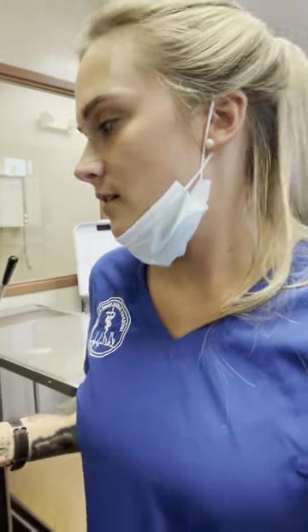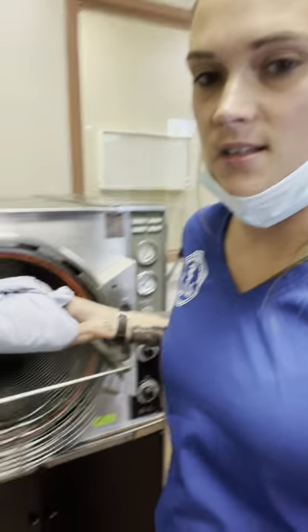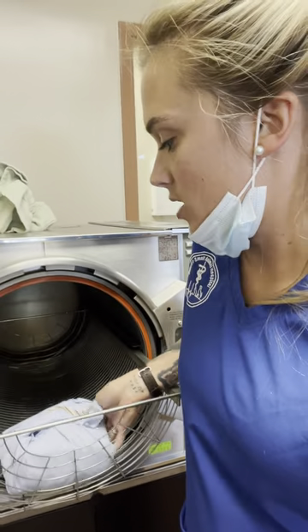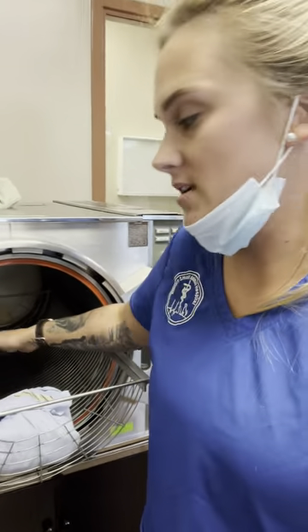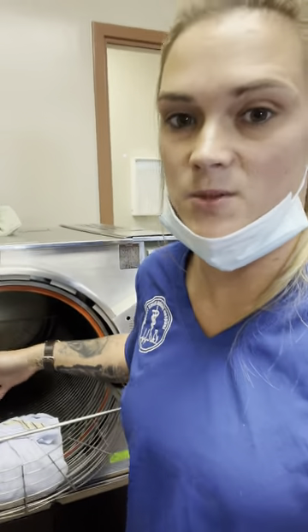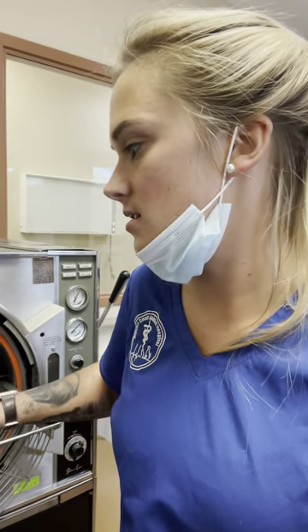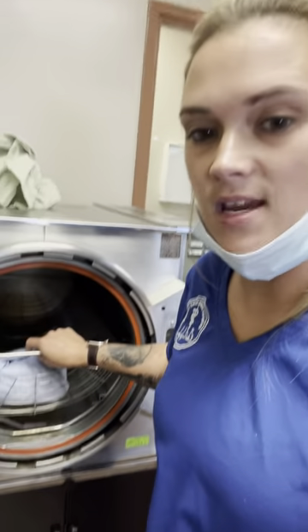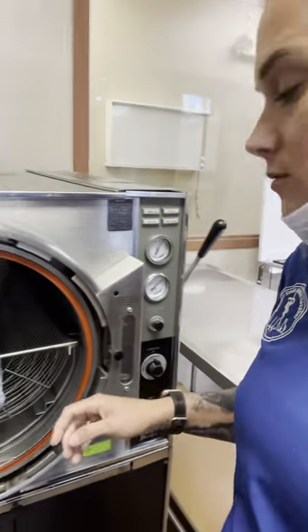I'm going to show you how to use the autoclave. You put your packs in here — obviously this one's already sterilized, but I'm going to show you. Put them in here, multiple packs, and you're going to space them out. Make sure there's enough room in between the packs so that they can properly sterilize. Stick them in here and don't stack them.